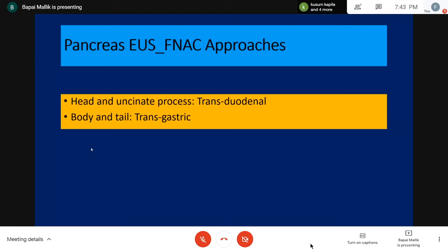And these epithelial cells, because of their appearances, might be easily confused with lesional cells coming from inside the cyst, which of course they are not. And so you should be very clear about the various morphological indicators which should help us recognize these cells as normal cells from the gastric and duodenal epithelium.